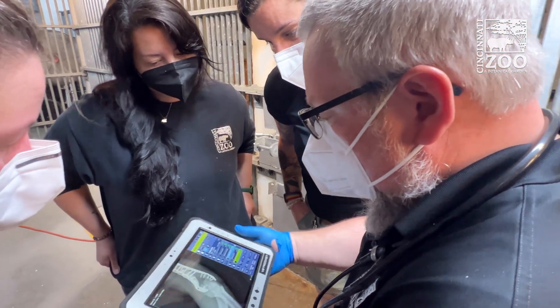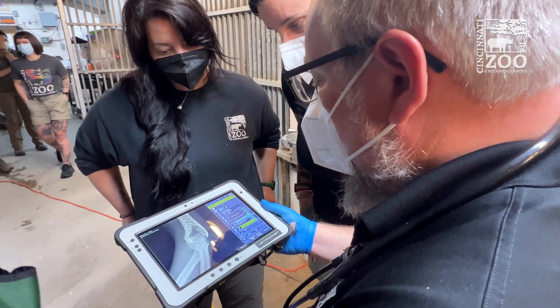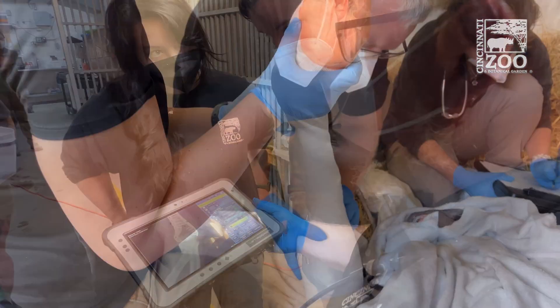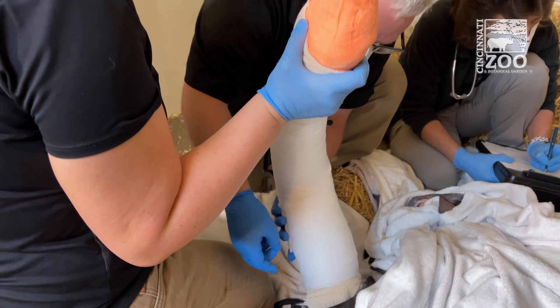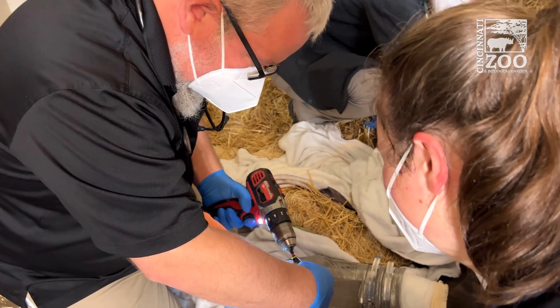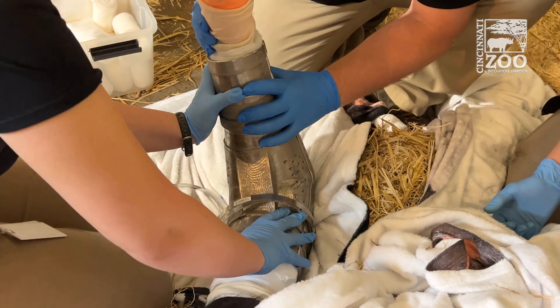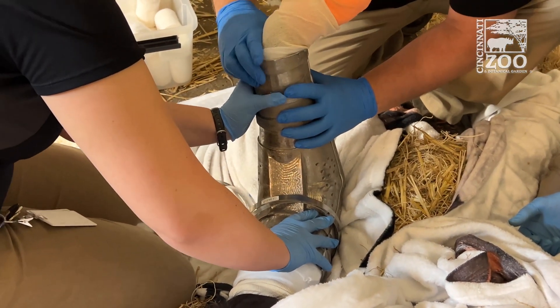We took radiographs to make sure things are healing well. At the fracture sites it looks like there is early bone callus formation, so the repair is holding it stable enough for her bones to heal together. It's taking a bit of time, just similar to what it would be in any other animal or a person.